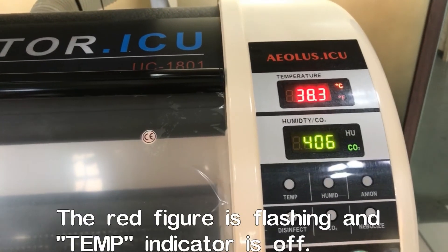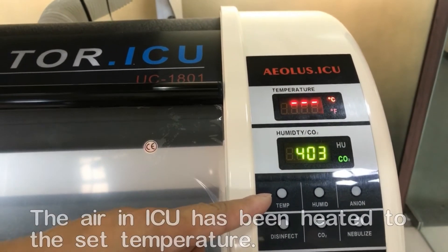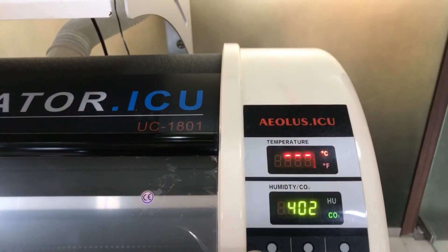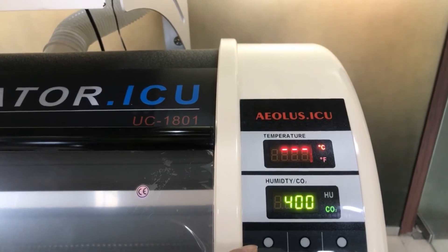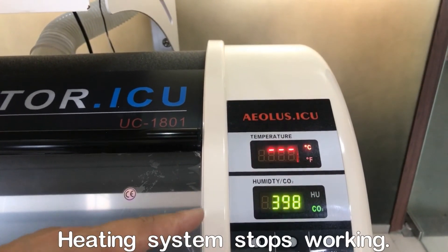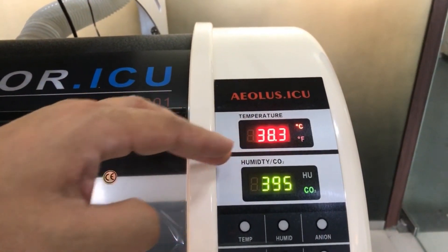At this moment you can see the temperature light is off, showing you it's not heating anymore. The temperature has reached the desired level at 38 Celsius degrees. The whole machinery has stopped heating and is holding at 38 degrees.